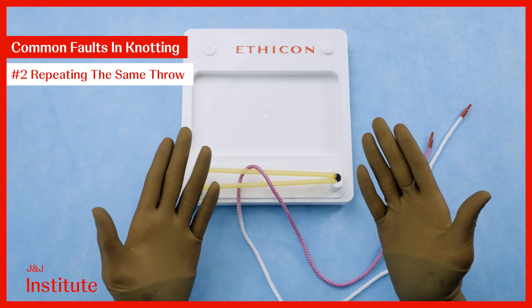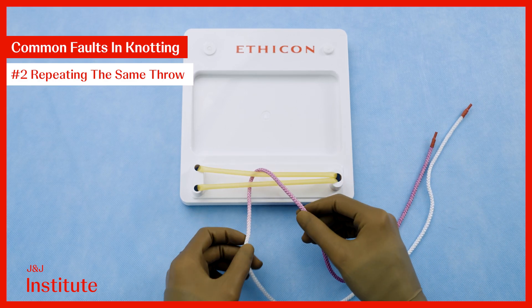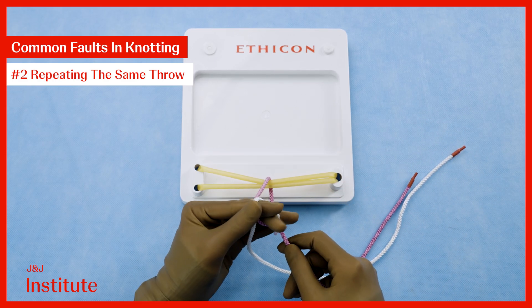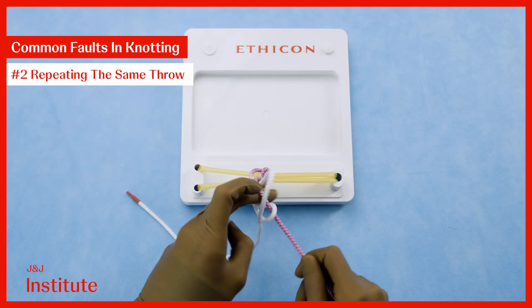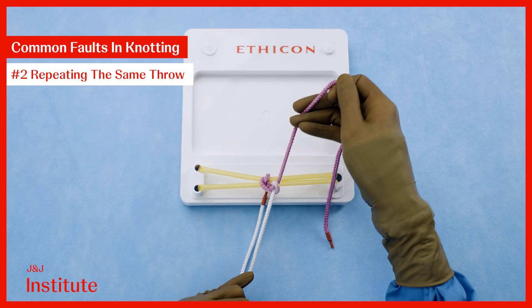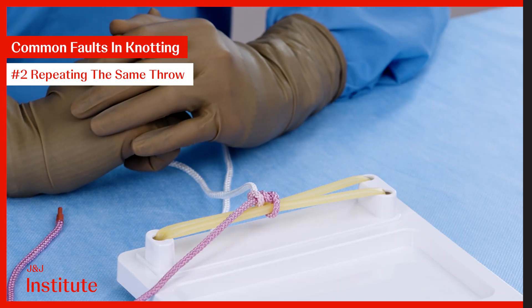What if we perform the correct throw to begin with but perform the same type of throw again? Here I am performing two going up throws and despite crossing my hands, this does not form a reef knot.